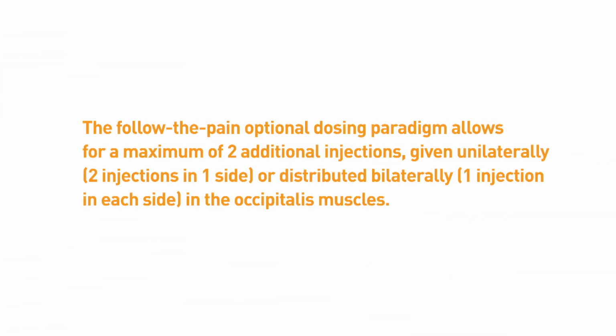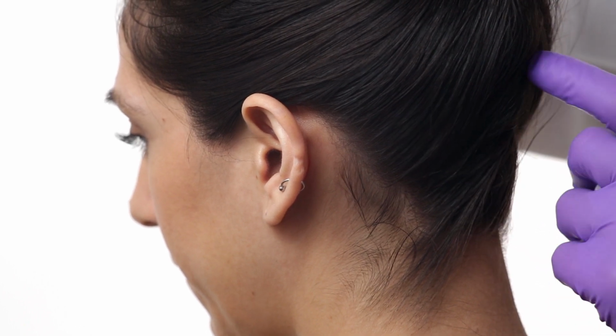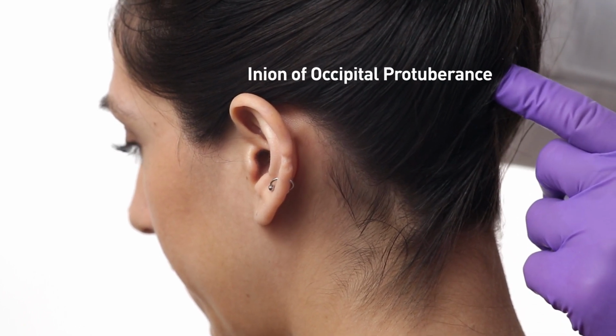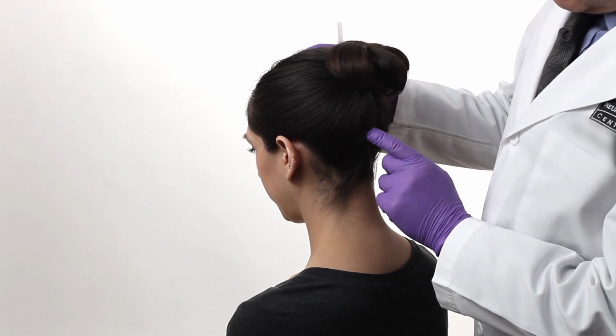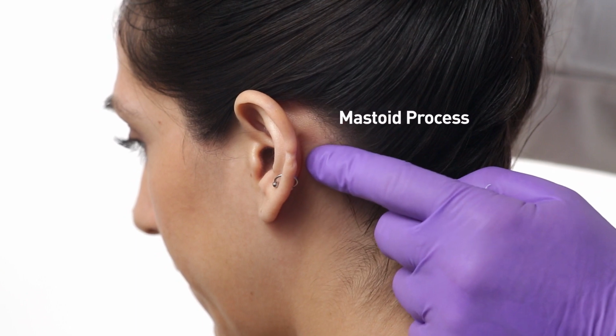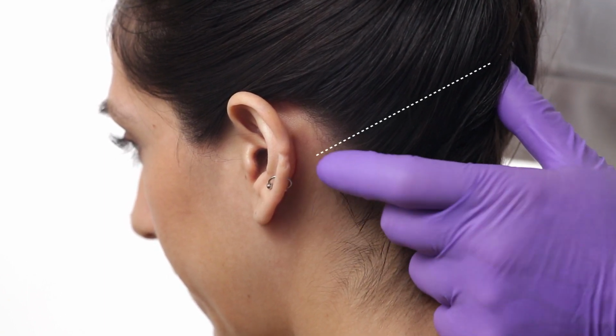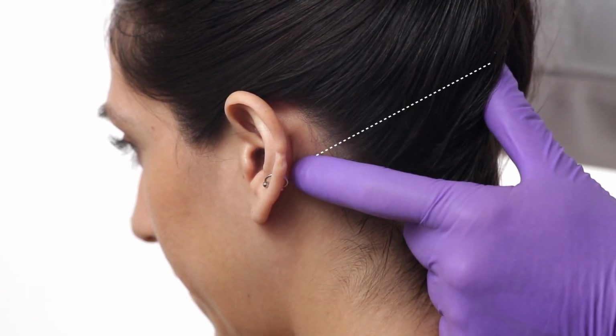The follow-the-pain optional dosing paradigm allows for a maximum of 2 additional injections given unilaterally, 2 injections in one side, or distributed bilaterally, 1 injection in each side, in the occipitalis muscles. To locate the first occipitalis injection site, palpate the occipital protuberance and find the inion, or most prominent midline point, of the occipital protuberance. Palpate the nuchal ridge and locate the mastoid process behind the ear. Then, place your thumb on the midpoint of the occipital protuberance and your index finger on the mastoid process.